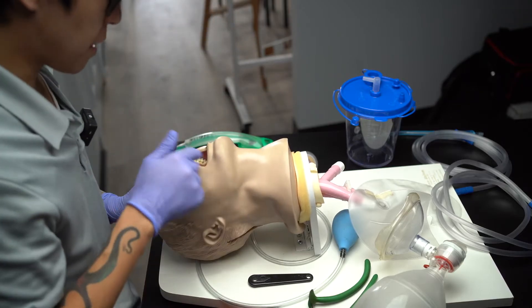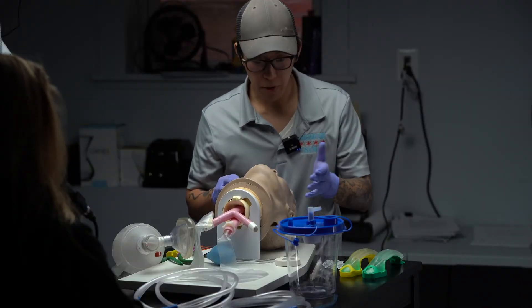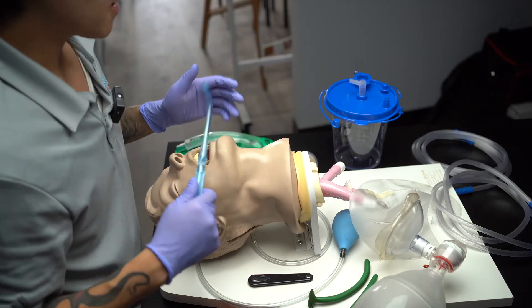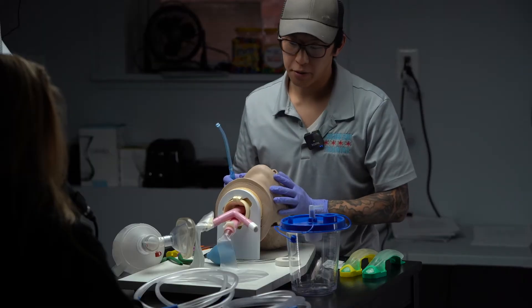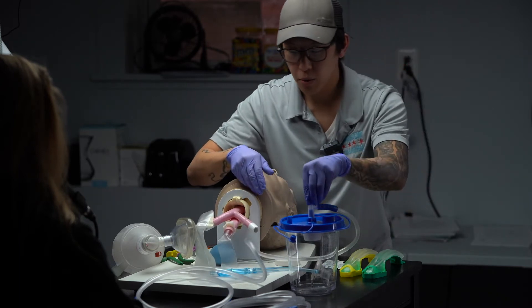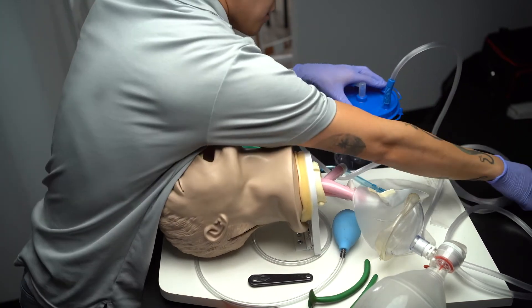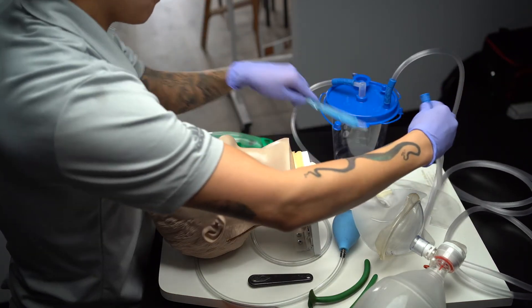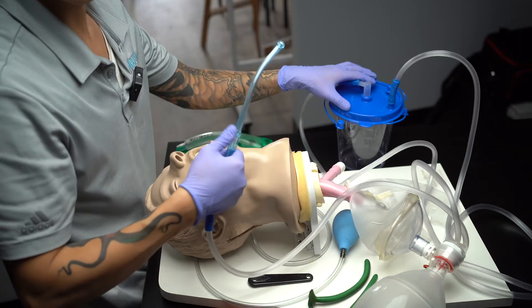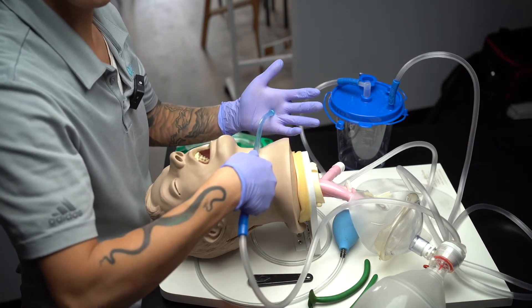I'm going to look in the mouth to see any blood, vomit, or secretions. You do see vomit in the mouth. I'm going to set up my suction. I've got my canister, my two tubings, a Yankauer rigid catheter. One set of tubing goes from the vacuum port to the suction device, and the other tubing goes from the patient port to the Yankauer. I'm going to turn the machine on and test the suction power on my gloved hand. Do I have suction power? Yes, you have suction.